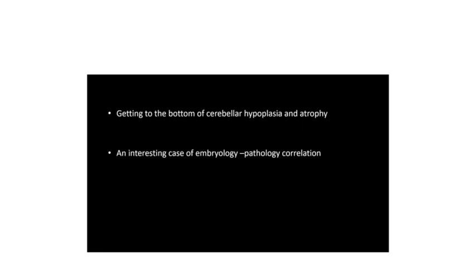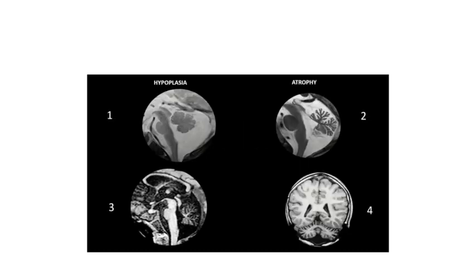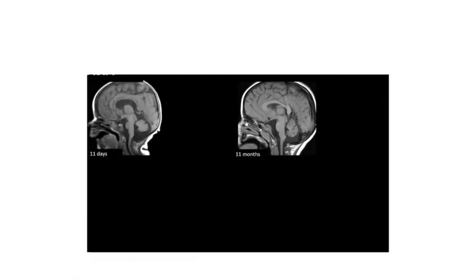So let's start. Today we'll look at cerebellar hypoplasia and atrophy in some detail and clarify those concepts. And we can also see an interesting case of embryology pathology correlation. So we will clarify these concepts through four scenarios. One is hypoplasia versus atrophy. And let's get into that.